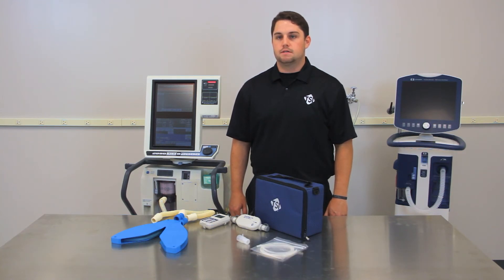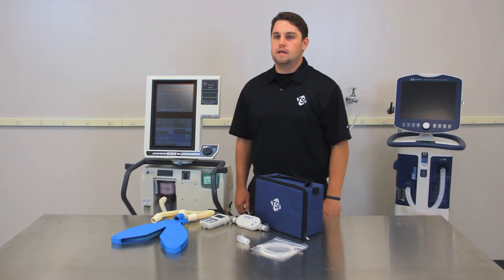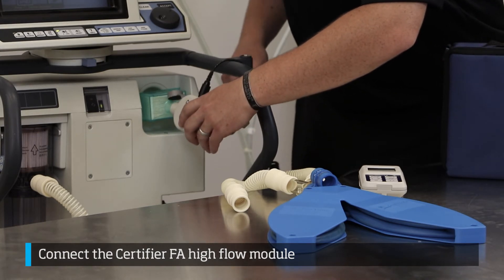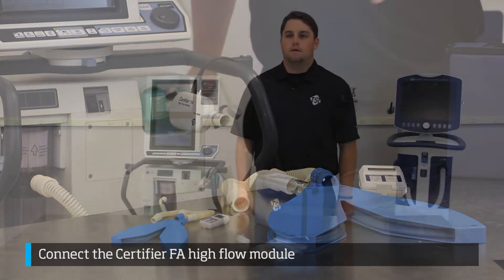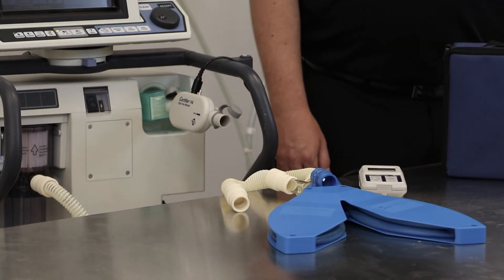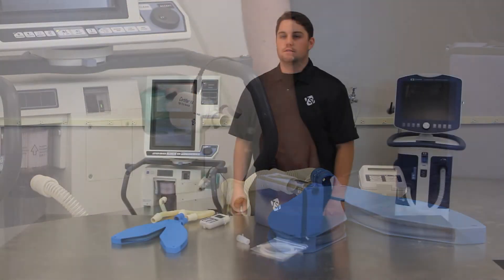After that has been done, connect the Certifier FA high flow module to the end of the filter we have just installed. Make sure the flow arrow on the module is pointing away from the ventilator towards the test lung.